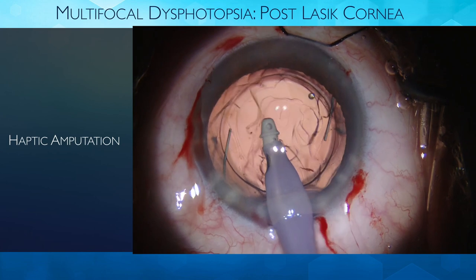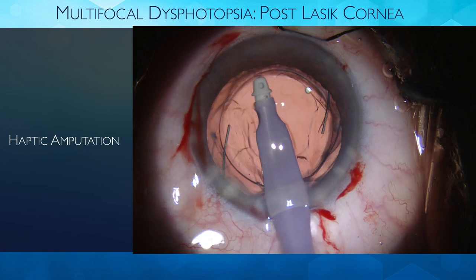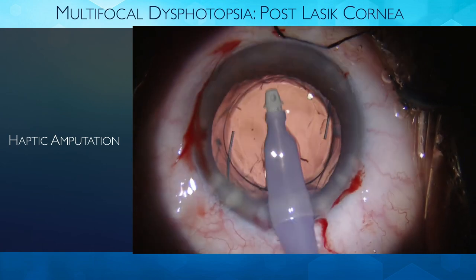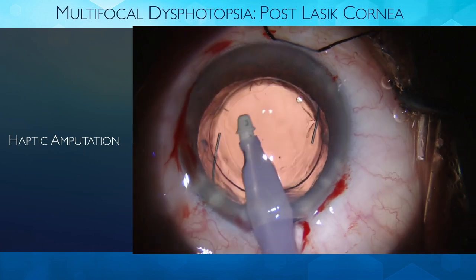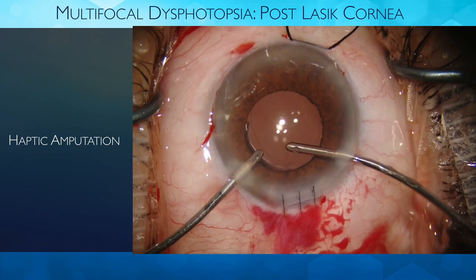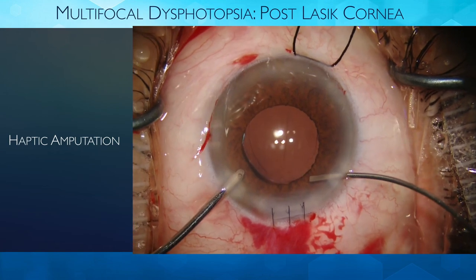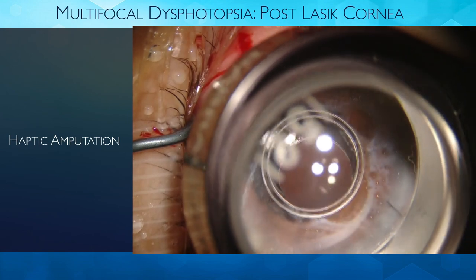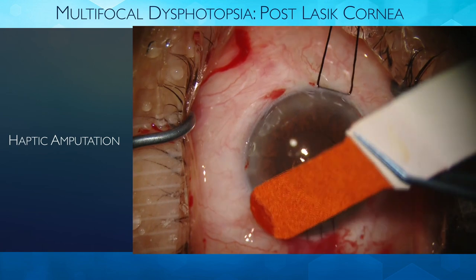If you use dispersive viscoelastic, you have to spend more time removing it. Cohesive comes out more easily. Be careful during these cases not to overfill, which can cause iris prolapse. We give oral medication such as Diamox to relieve intraocular pressure overnight. Make sure to use miotics to bring the pupil down, check that the eye is normotensive, and the patient is safe overnight until the next visit.